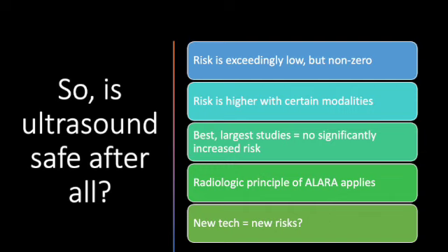Now, the risk is higher with certain modalities. If we're using continuous wave Doppler or power Doppler or some of the other high intensity modes, we should know that and know when it's appropriate or not appropriate to use those modalities on our patients. The best and largest studies of safety in ultrasound have shown no significantly increased risk. However, it is still important that we know that this technology is evolving and changing, and the principle of ALARA certainly applies even to ultrasound.